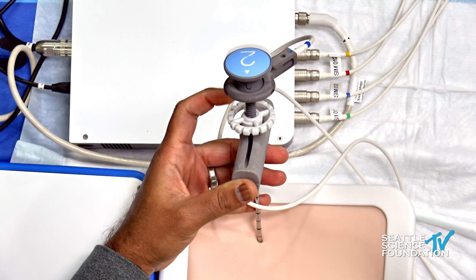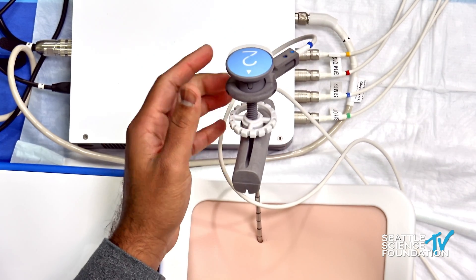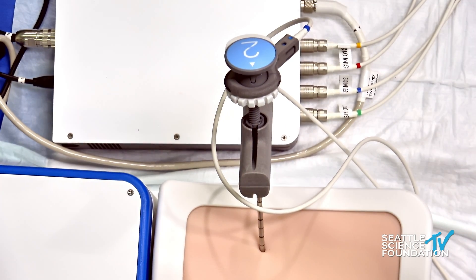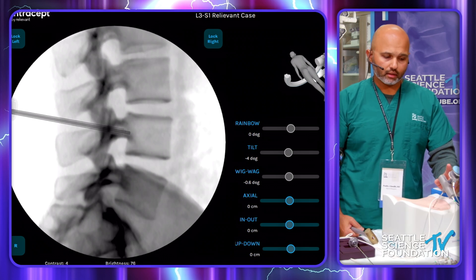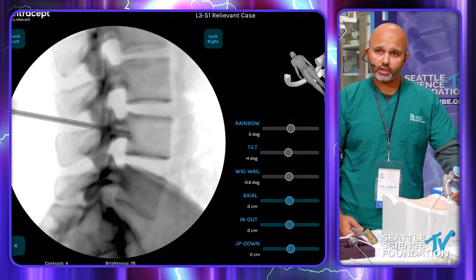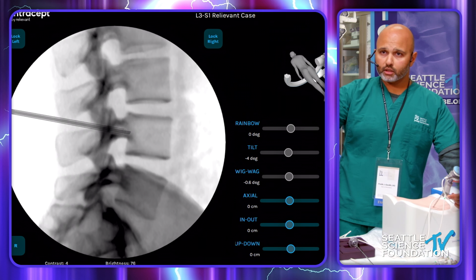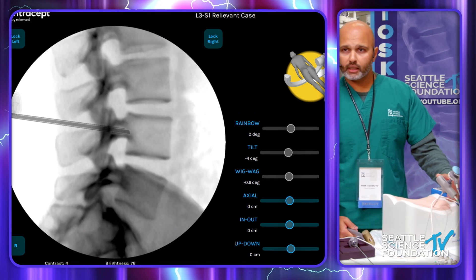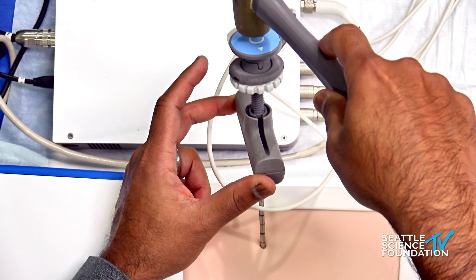This whole assembly comes together and we feed the J-stylet in. This gear wheel is essentially a nut that blocks the stylet from being malleted - if you try to mallet with it down, it won't go. So we bring this gear wheel up all the way. On imaging, you can see which direction the J-stylet is going. The new feature of this J-stylet is that it has directionality: when you turn it upwards, the image shows the tip pointing up; turn it the other way and you can see it curve down. We'll go slightly south but keep it as is and start malleting.